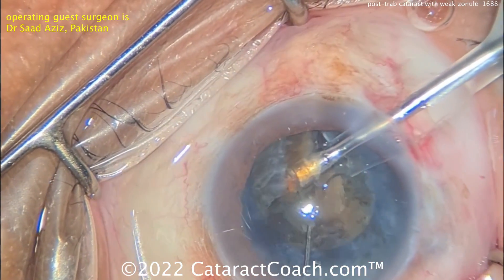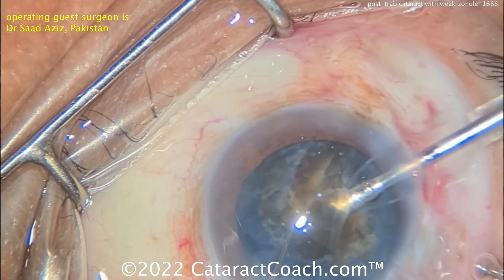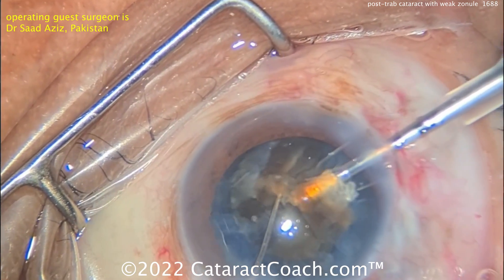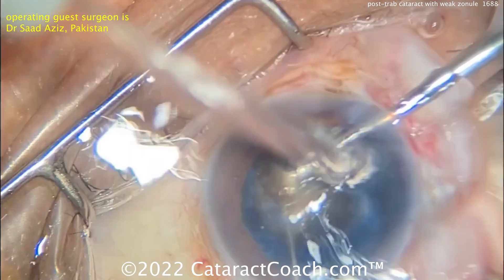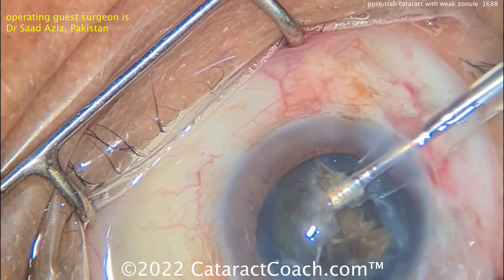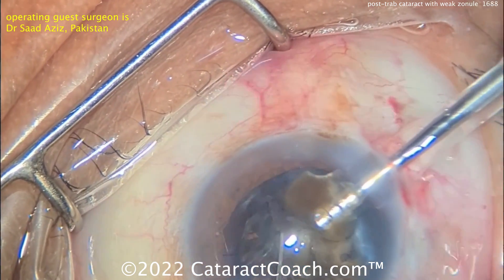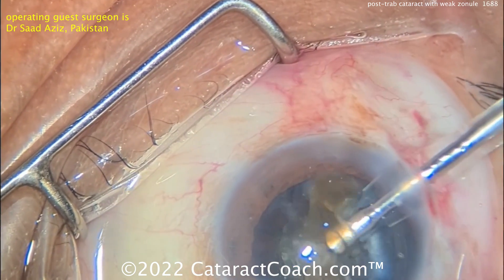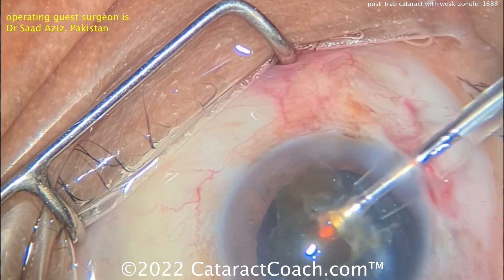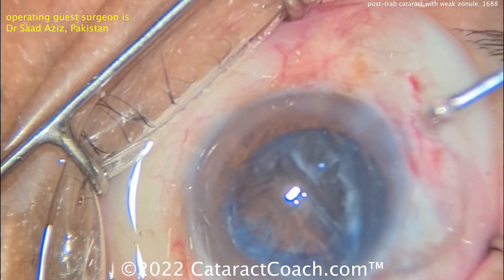Buzzing into the nucleus — just take your time and chop it into smaller pieces. You're lucky in this case that there's a non-functional bleb. If the bleb was functional, remember, that's an additional source of outflow. What's the one source of inflow? Your BSS bag or bottle. And your outflow? Through the phaco tip which you aspirate, leaking through the incisions — because the paracentesis and the main incision do leak in order to cool the phaco needle — and also fluid egress through your trab site if the trab was functional. All those together combine to give outflow, and we've got to balance inflow with outflow to get chamber stability and have less risk of capsule rupture.